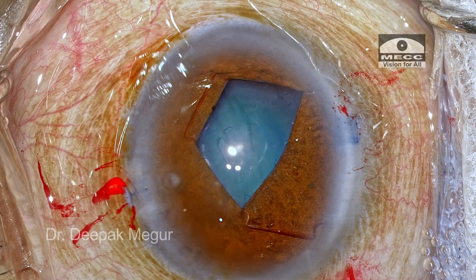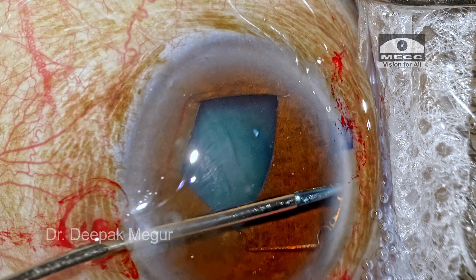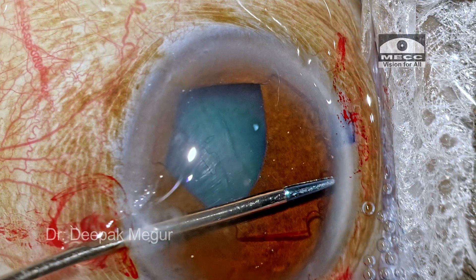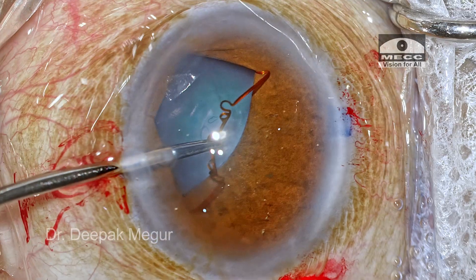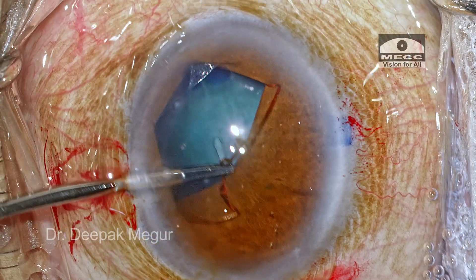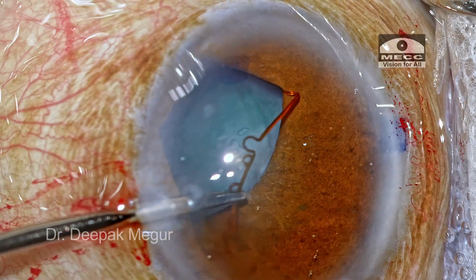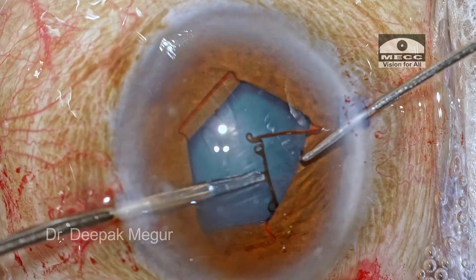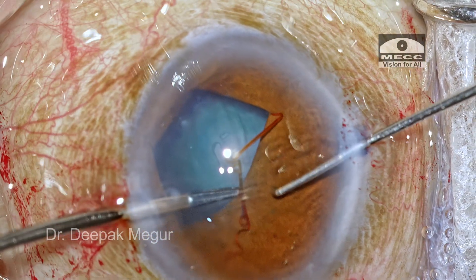Now it's time to engage the last pair of notches. The hands are switched — I need to go with my left hand to do that. Now we can see that something unusual is happening. I am unable to engage the notches on the pupil margin simply because the ring is too malleable and the tensile strength of the ring is too low for the rigidity of this pupil.